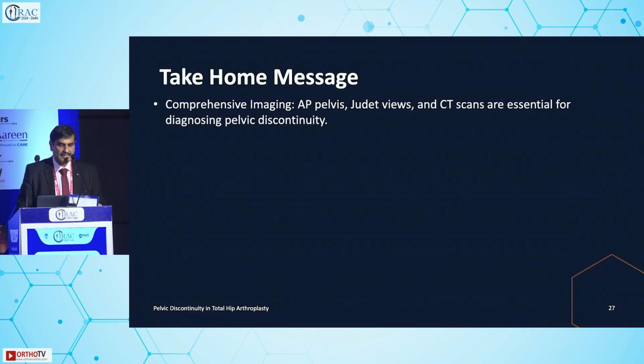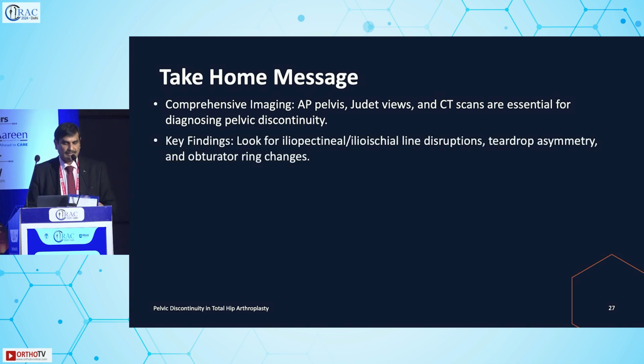The take home message is that multiple images and different views will help you some of the time to diagnose things. You need to check for the iliopectineal and ilioischial lines and obturator rings. Special views may be required, like the false profile view. CT scan is the gold standard. Wherever you have a chance, you need to do a CT scan, and 3D modeling will help you to diagnose a pelvic discontinuity. Thank you.